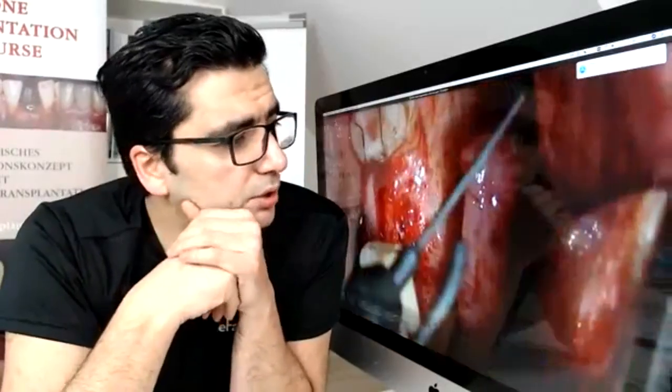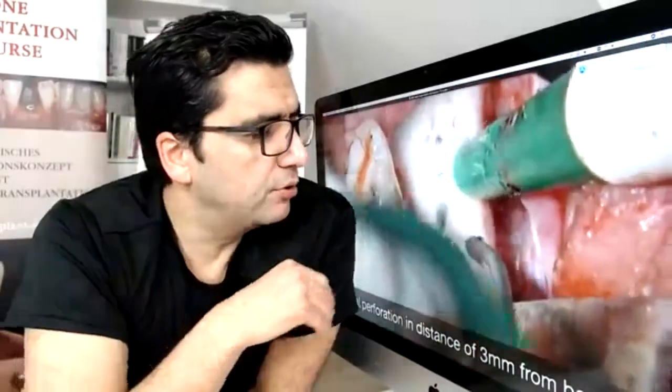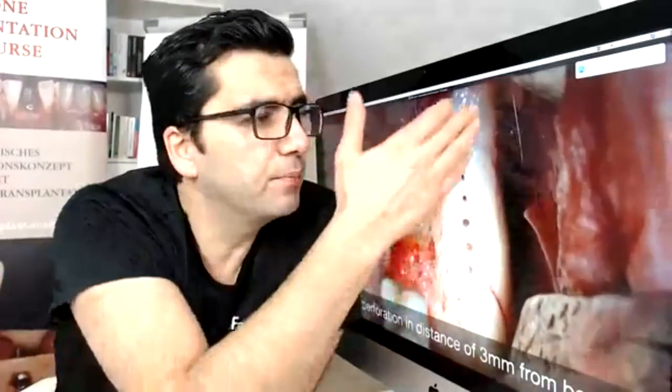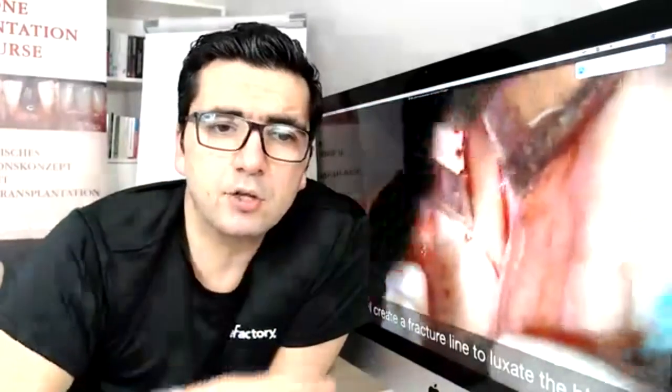The next step in our safe bone harvesting protocol from the retromolar area is perforation of the crestal area, nearly three millimeters away from the border of the linea obliqua externa toward the lingual side. This is very important because we want to obtain a bone block that is thick enough. You can see how thick the cortical area of the linea obliqua externa can be — minimum three to four millimeters of cortical bone.